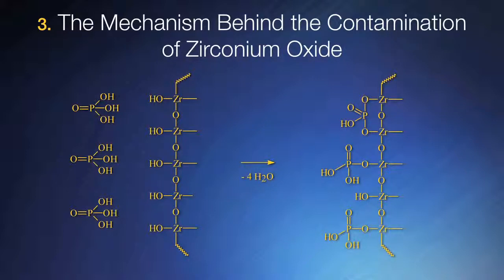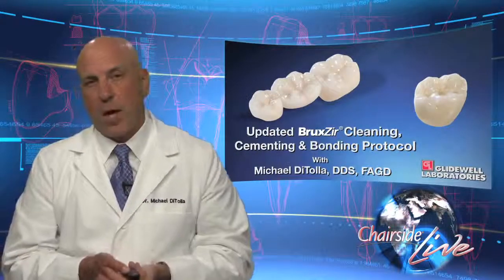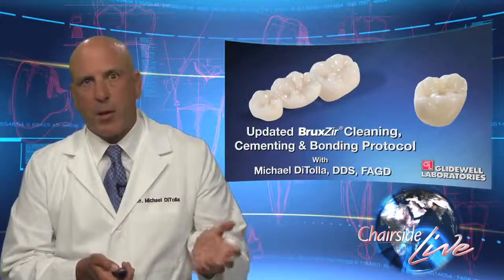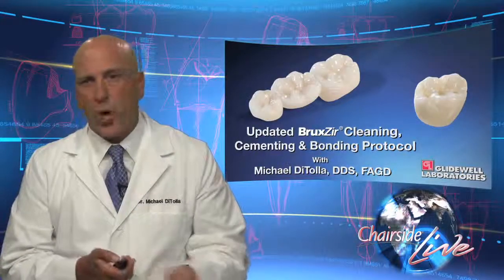As it turns out, we're going to use these bonding sites to our advantage, but we've got to get rid of the salivary phosphate groups that are still in place. So how do we get rid of these phosphate groups that are bound to the zirconium oxide on the inside of the BruxZir crown? Well, most dentists don't have a 50 micron aluminum oxide sandblaster in their office that they can use all the time.